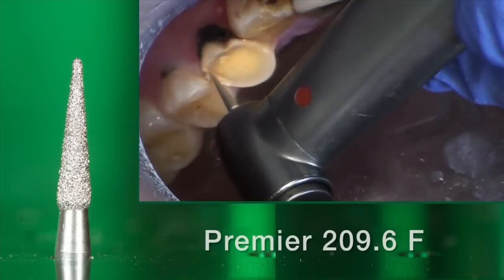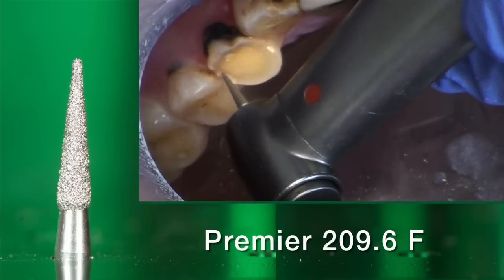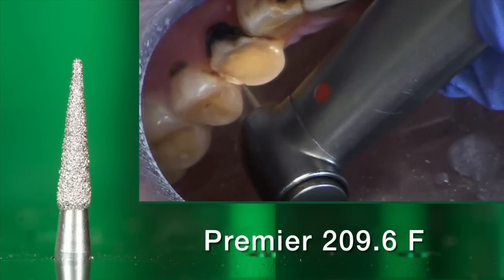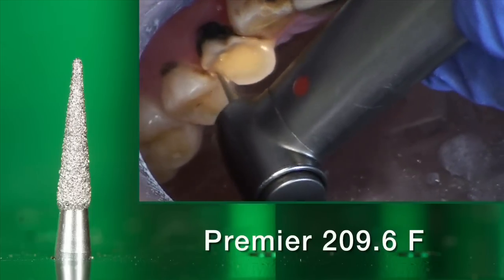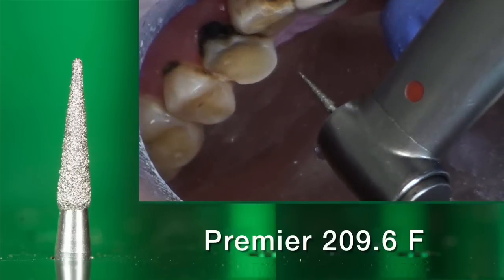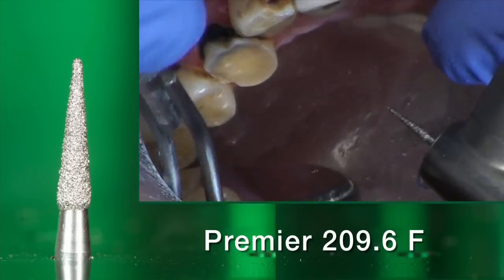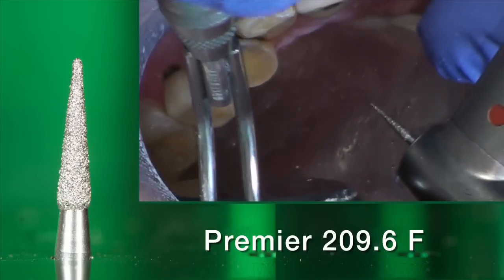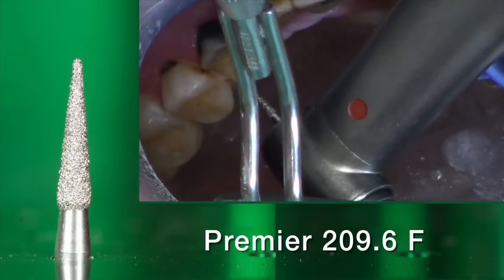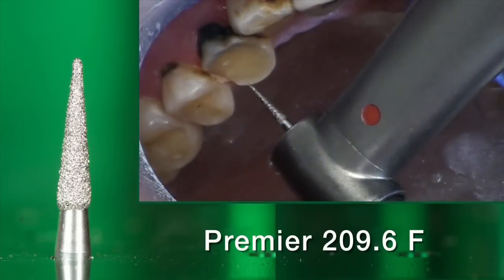Next, we're going to pick up a flame shape burr in order to break the interproximal contact. The obvious goal here is to avoid inadvertently damaging the proximal surface of the adjacent tooth or teeth. Now we might choose to recontour the adjacent surface if we're not happy with the proximal tooth contour.